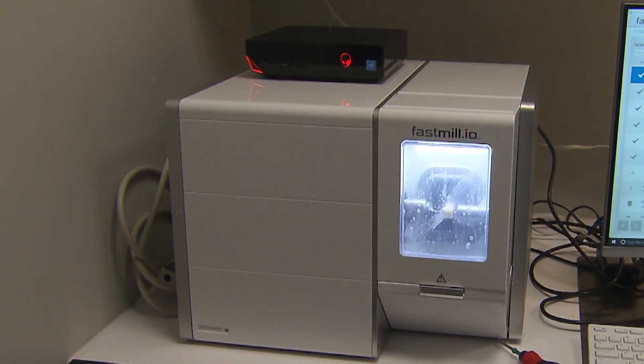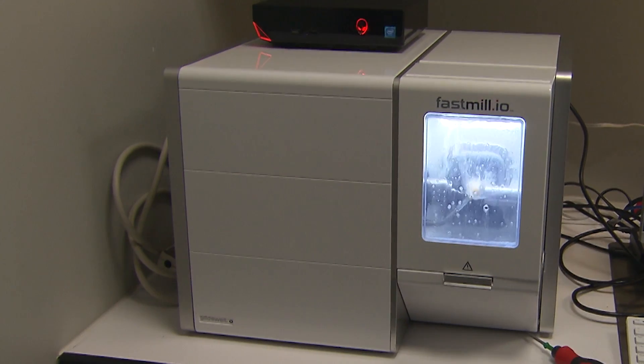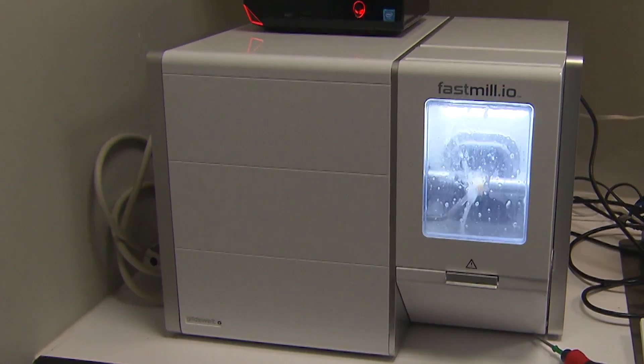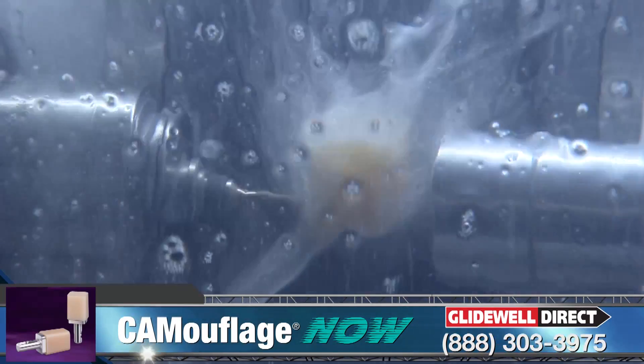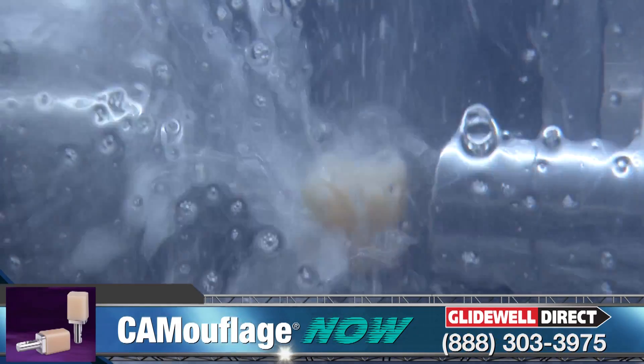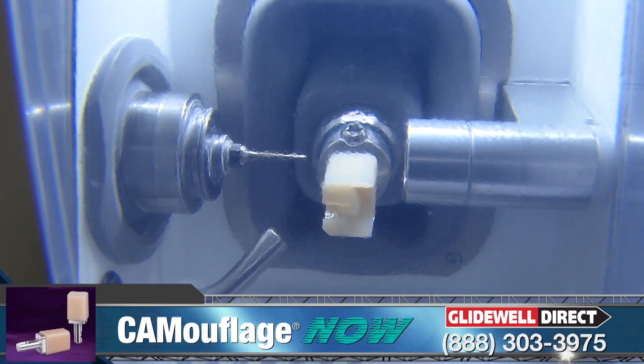Once I'm finished setting the proximal and occlusal contact parameters, the ElectricFastMill.io machines this onlay in only seven minutes using Camouflage Now, which is a hybrid resin ceramic material that I really like using for partial coverage restorations.